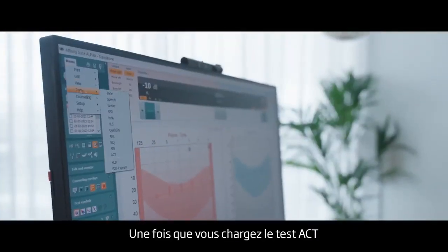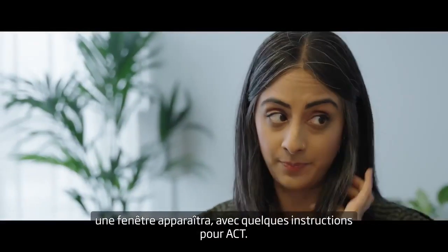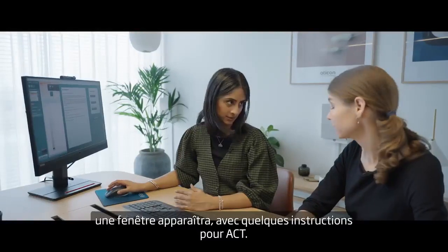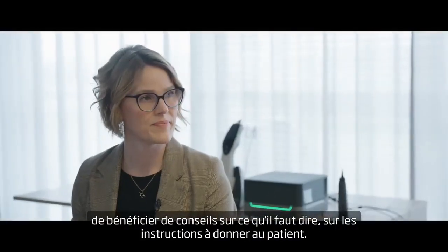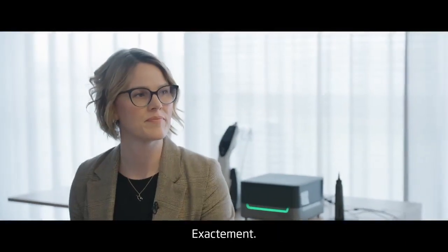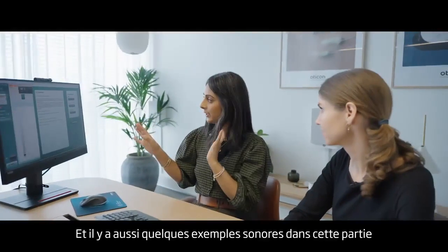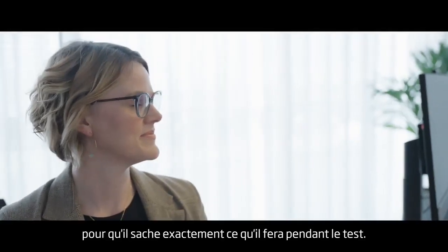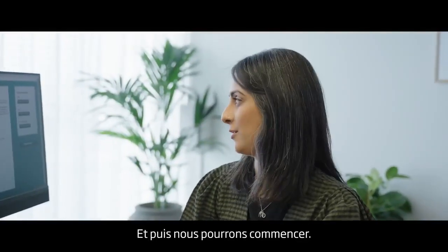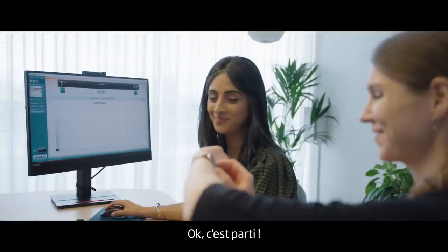Once you go into ACT, a box will populate with some instructions for ACT. So it gives the clinician some guidance as to what to say and how to instruct our client. Yeah, so that you know you've remembered to say everything. Exactly. And there are also some sound examples within this portion, which will allow you to familiarize your client so they know exactly what they're doing in the test. Would you like to pop on the headphones, Susanna, and we can get started? So, ready? Yeah, I'm timing you. Okay, go.